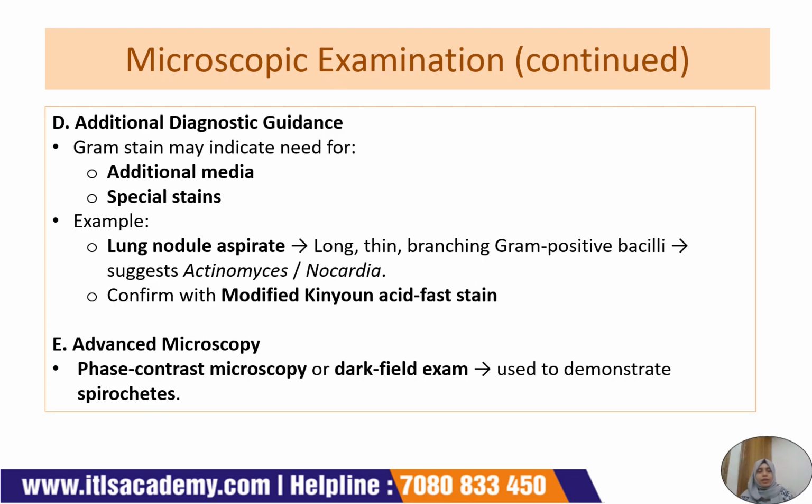Now, what is the additional diagnostic guidance? First of all, results of the gram stain may indicate the need for additional media or special stains.